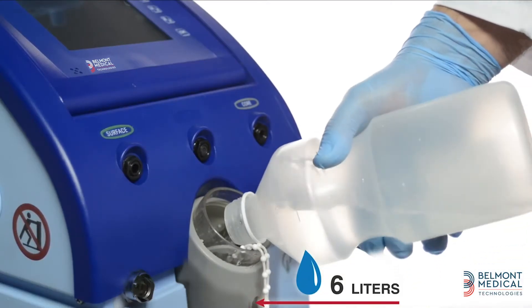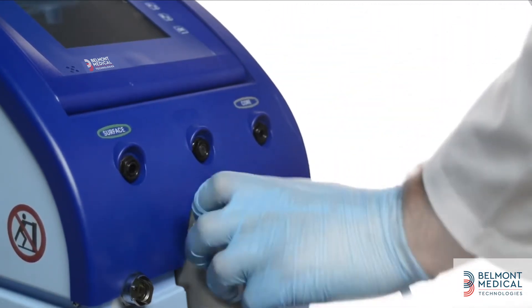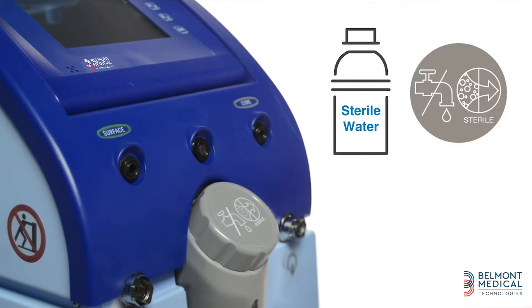First, fill the water tank up to the upper level line. A full tank has 6 liters of water. The system uses only sterile or 0.22 micron filtered tap water. Make sure to use only these kinds of water.